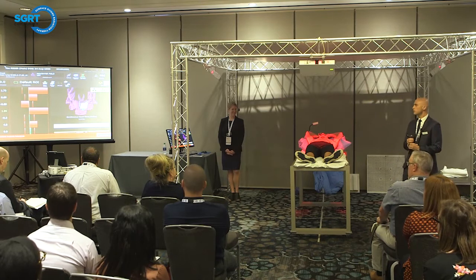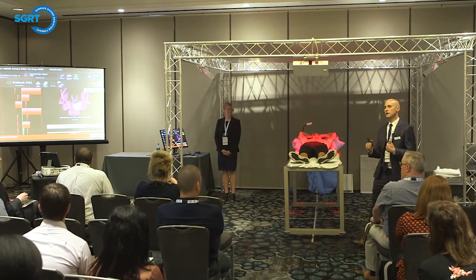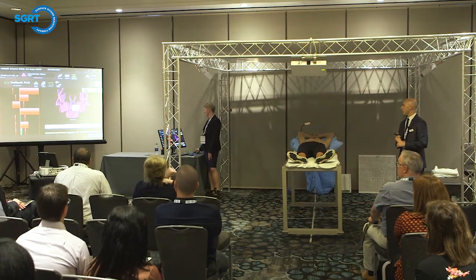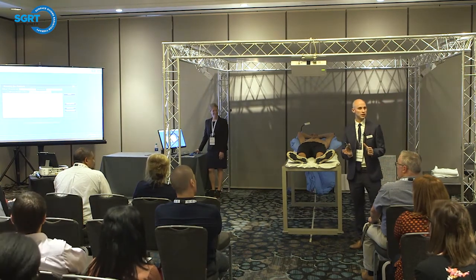So now, once we've delivered the full prescribed dose for the deep inspiration breath hold technique, then the last letter of our 5 steps is T, which is terminate. Okay, perfect. So we're going to terminate, pause, and exit our patient, right? And now we're complete with the deep inspiration breath hold treatment. Any questions on that process?